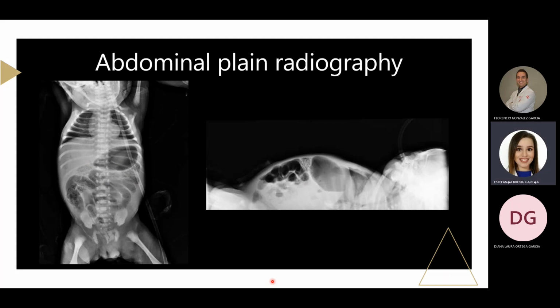With these images, the question arises as to whether there was any complication such as free fluid or intestinal perforation. So we decided to practice an ultrasound.